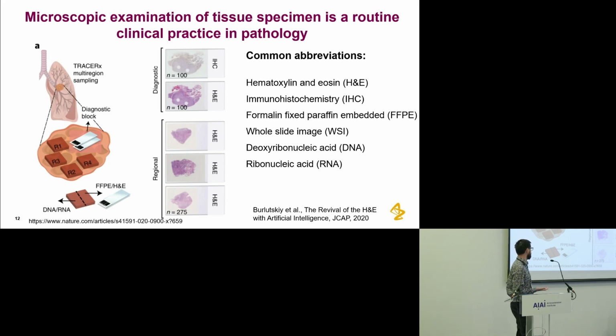These days, of course, there are also advances happening, and for example, you can also stain tissue for expression of a specific protein. Immunohistochemistry enables one to look into specific protein expression. And of course, there is genomics, with the revolution in whole exome sequencing getting cheaper and cheaper.